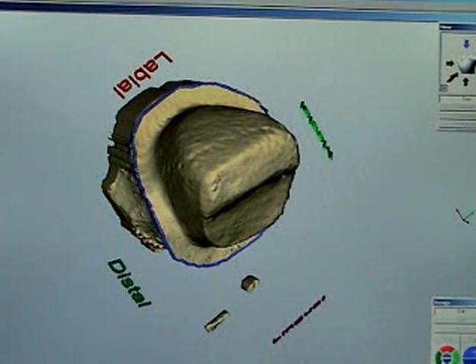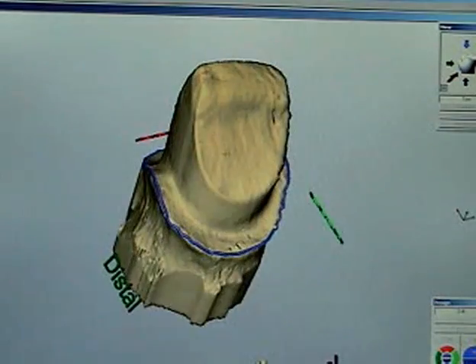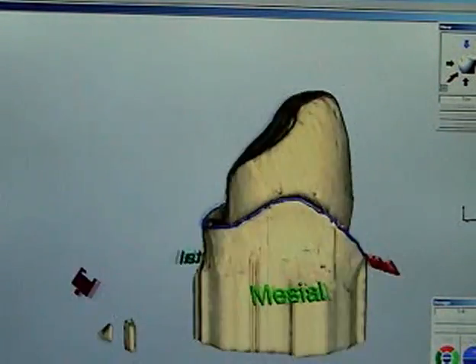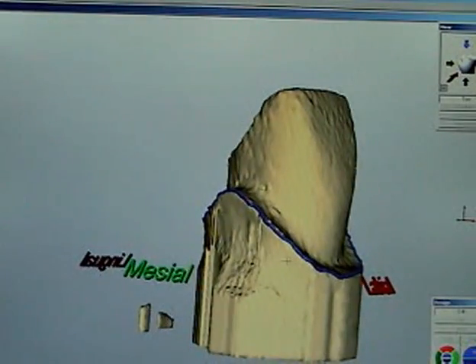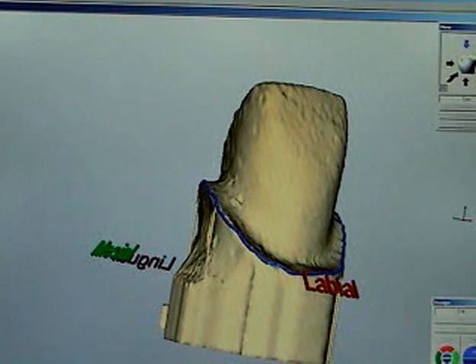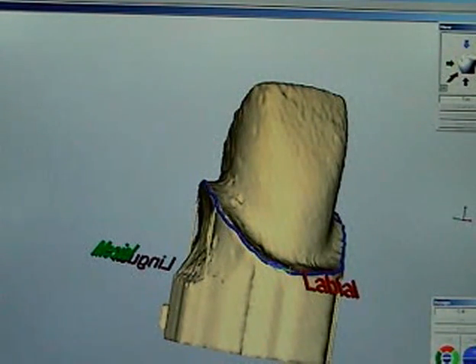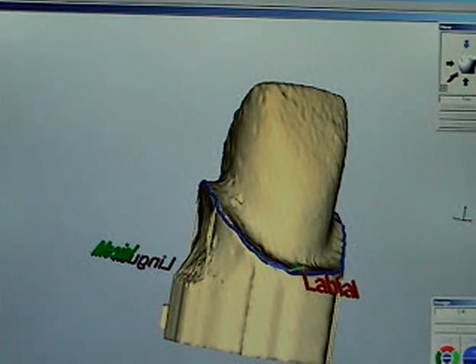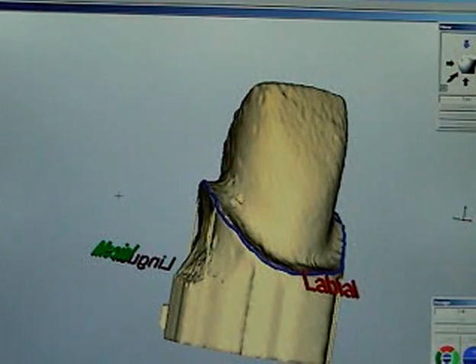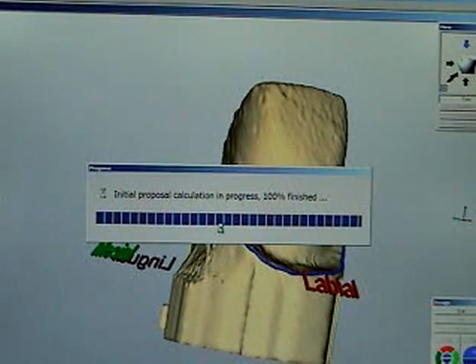Once you've done that, it automatically goes to the edit margin mode. So you can turn it round and check to see whether it's okay. Make sure it's not dropped off anywhere. And if it has, you can correct it at this stage. I should point out you're doing all this with the mouse, aren't you? It's all on the left and right clicking. It's quite straightforward. So we've just patched it up there. Onto the next stage.